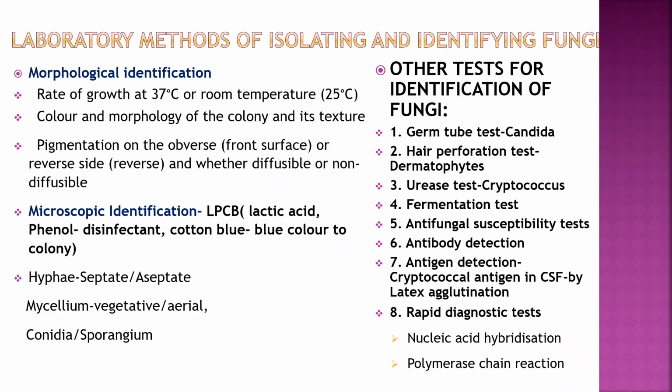Then other tests for identification of fungi: germ tube test in Candida, hair perforation test in dermatophytes, urease test in Cryptococcus, fermentation test, antifungal susceptibility test, antibody detection, antigen detection, such as cryptococcal antigen in CSF by latex agglutination, rapid diagnostic test, nucleic acid hybridization, and polymerase chain reaction test.